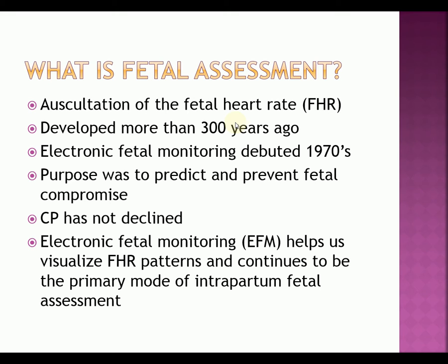Labor is a period of physiological stress for the fetus, so monitoring our fetus is part of the nursing care that we do during labor. One of the things we're really watching for is to make sure that our fetus is highly oxygenated during labor so that we don't see a compromised fetus when we come out. Let's go to the next one.